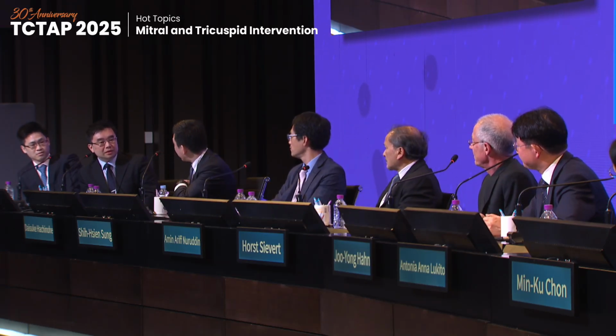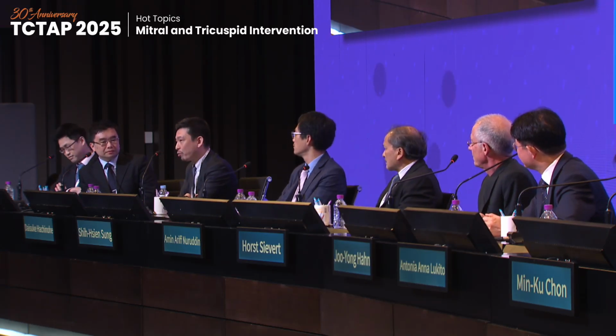Okay. So can I ask Simon? Yes. So regarding TEER and TTVR, of course anatomical feature is very important, but RV function is also very important. So TTVR can eliminate TR completely. So if patient has very poor RV function, that may lead to very bad condition. So do you have any cutoff RV function, or do you have any timing of TTVR like that?